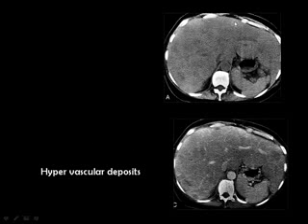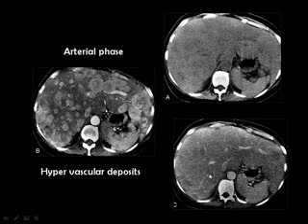Then this is a pre-contrast scan, and look to the aorta, and this is a post-contrast scan. The aorta is stained with contrast material. The liver is markedly enlarged, and you may imagine that there may be some of the focal lesions scattered throughout the liver. But in this examination, which is also a post-contrast study, look to the aorta, and you can identify so many hepatic focal lesions.